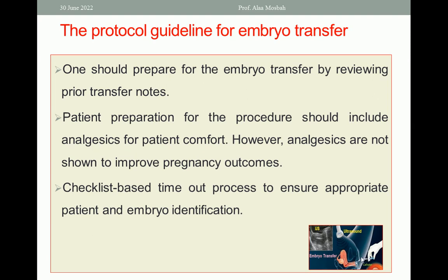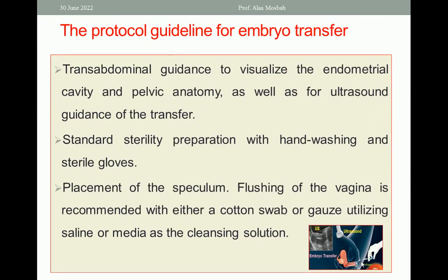Okay. Next, a checklist-based timeout process to ensure appropriate patient and embryo identification. Okay, as we mentioned before, transabdominal ultrasound guidance to visualize the endometrial cavity and the pelvic anatomy, as well as for ultrasound guidance of the transfer.